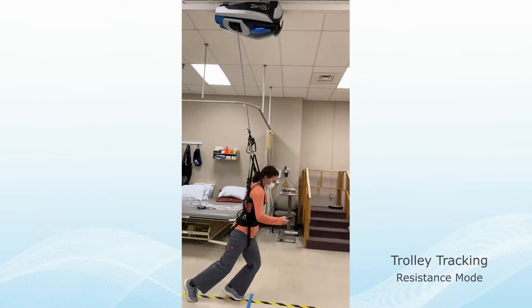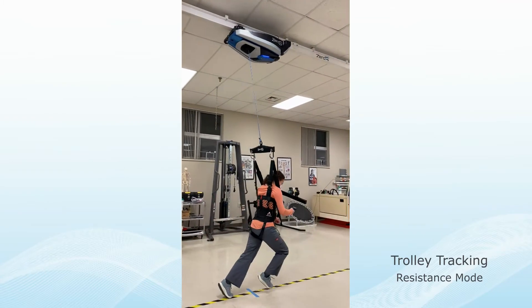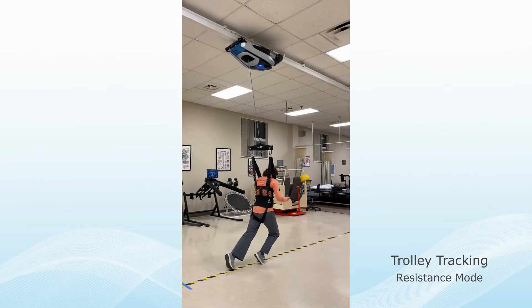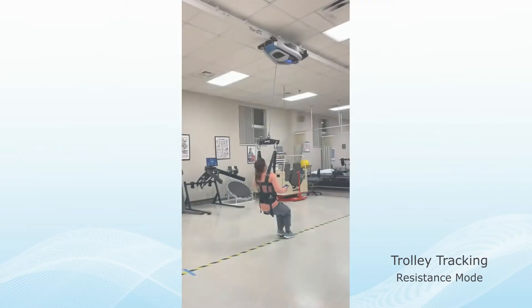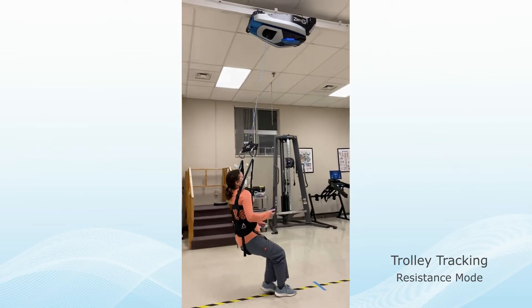In Resistance Mode, the Zero-G robot positions posterior to the subject. The clinician can customize the level of resistance to work on improving strength, balance, postural control, and endurance.